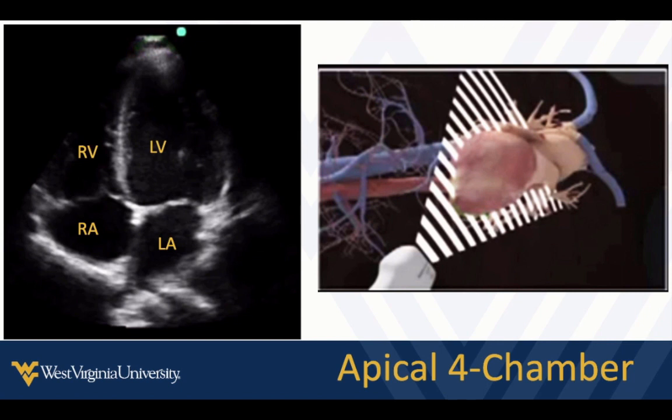From here, we're going to bring the probe out to a different position on the chest. Our starting point is at about the sixth intercostal space in the anterior axillary line, with the indicator between 2 and 3 o'clock — so at about 2, 2:30 — and we're shooting the beam from that position towards the patient's right scapula.